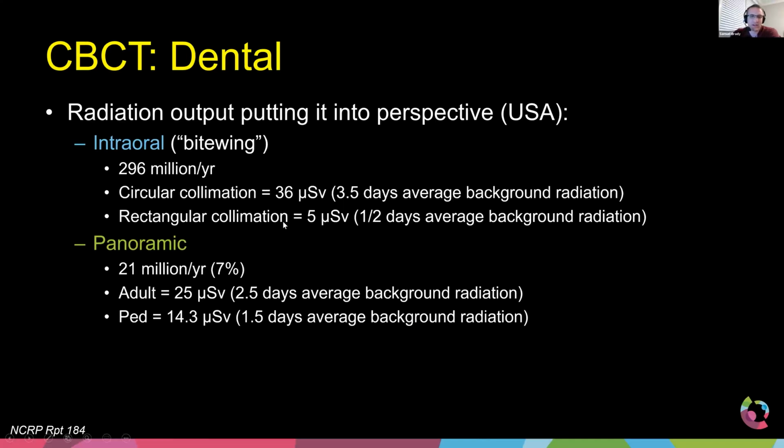So that's something that we always talk about. I always advocate, if you're trying to reduce dose, especially in an intraoral circumstance where most people get intraoral scans every year as part of their dental hygiene, you should try to make it as low as possible. And that's kind of the same concept as mammography. We recommend all women get it after a certain age. Well, if that's the case, then we should make it as low as possible to keep everyone as safe as possible. So how does a panoramic compare to that?